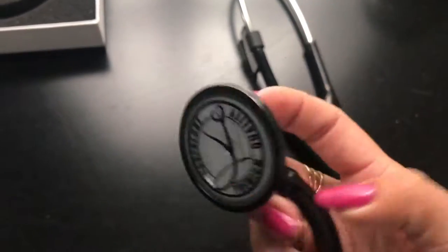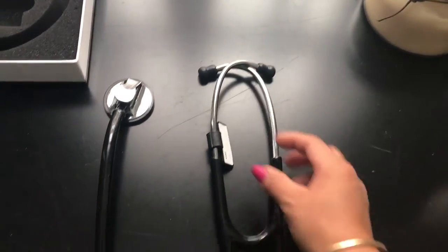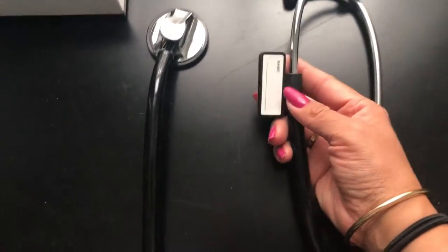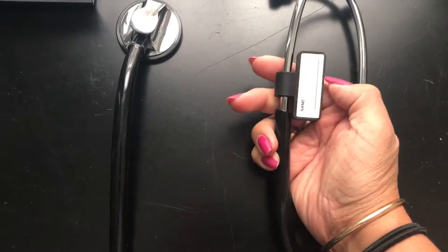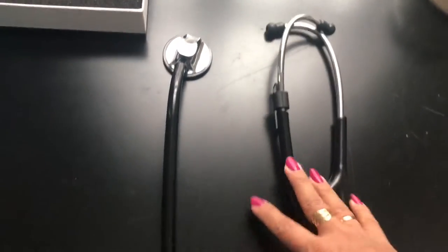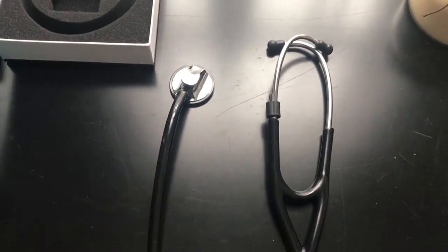When you use it, you can clearly hear the heartbeat. What I also like is the fact that it comes with an identification, so it will be easy to relocate if you lose it. Overall, I think this is a really well-made product and I highly recommend it.